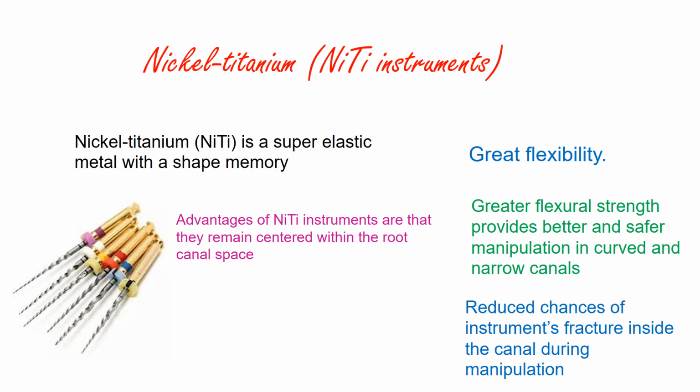This is the advantage with the niti instruments, that they are very much flexible and they can easily be used in curved and narrow canals. And also there are reduced chances of instrument fracture within the canal. That means the cyclic fatigue resistance of the niti instruments is very good in terms of your manual K files or hand files.